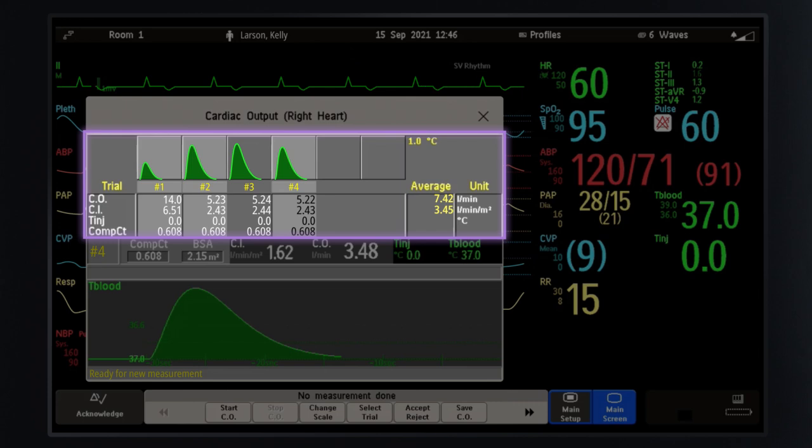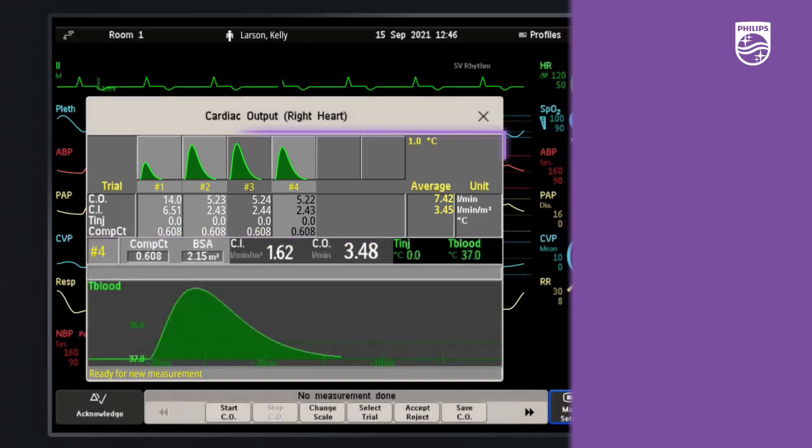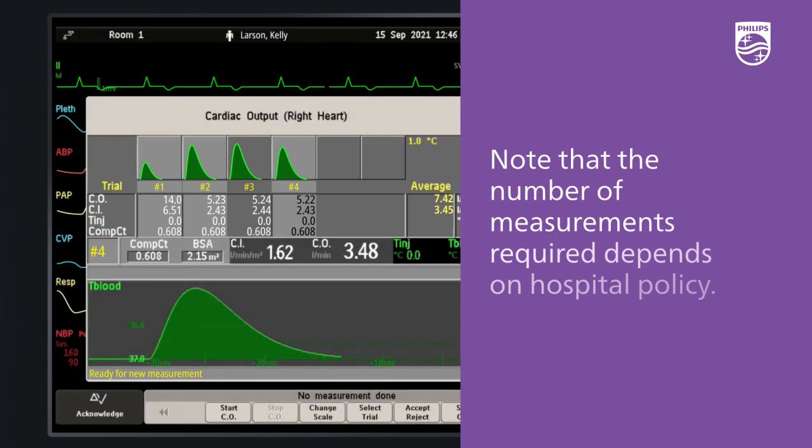In this example, you see that four measurement trials have been completed. Note that the number of measurements required depends on hospital policy.